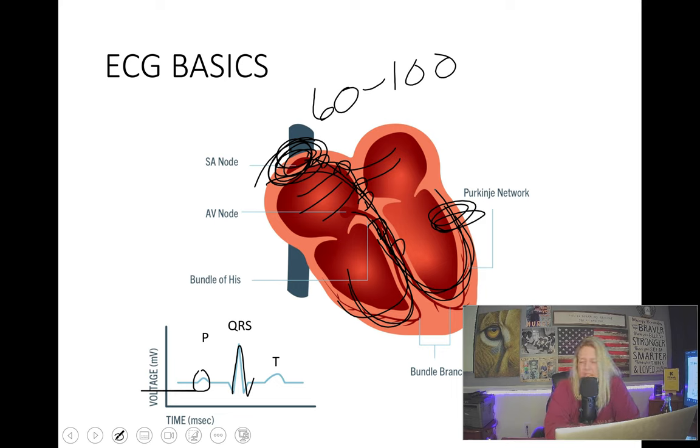Now, it may be a fast or a slow sinus rhythm, and so maybe I do need to do something, but it's not an emergency. The sinus node is going. I'm happy with that. That's what's supposed to be happening. Okay, let's look at another one.